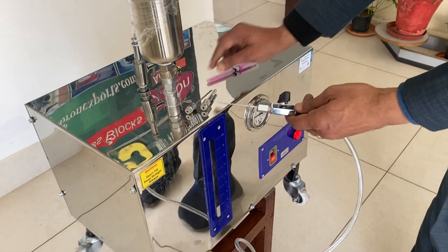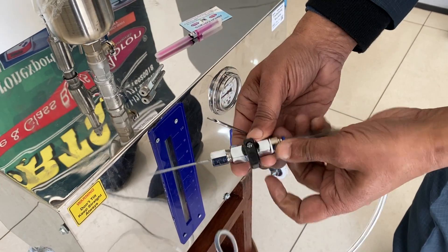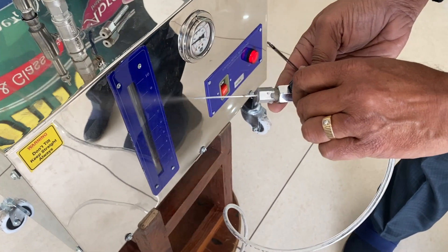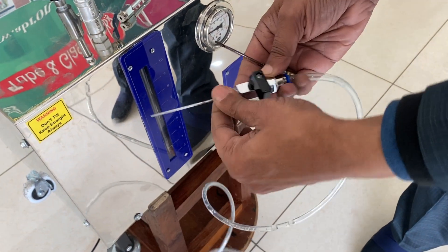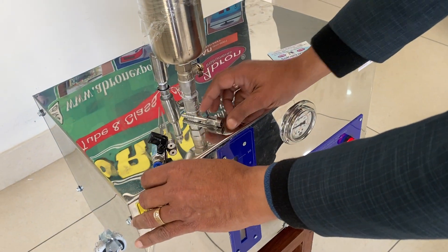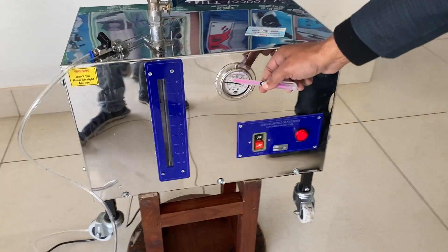There are two cannulas for putting the formalin inside the body. When you open this, start working — you have to tighten it properly. There is another cannula as well. Another nozzle is also provided for other uses in your lab. Now it's almost 30.